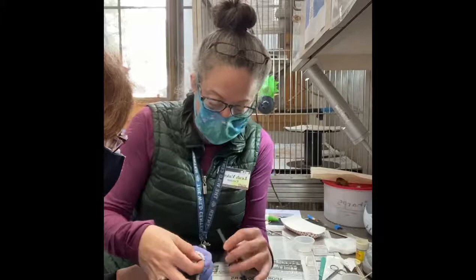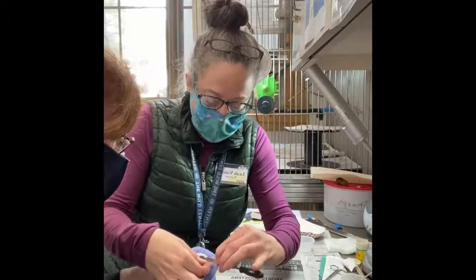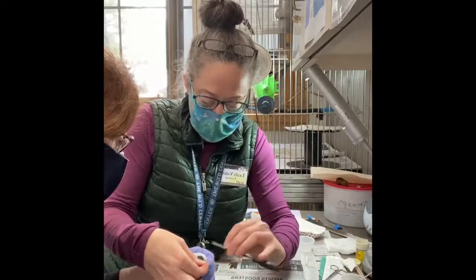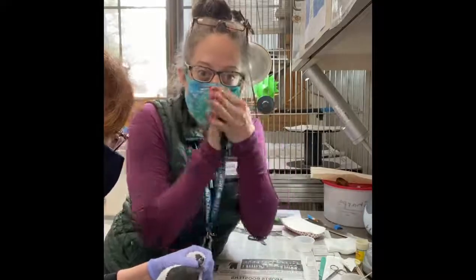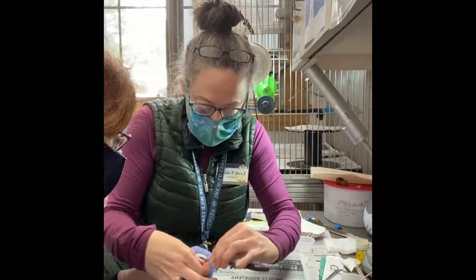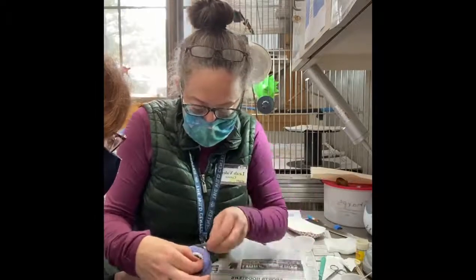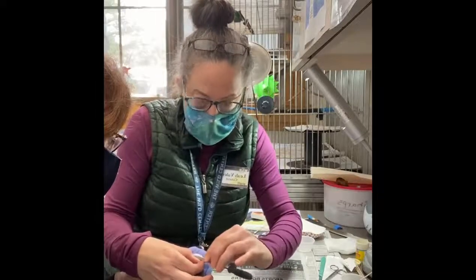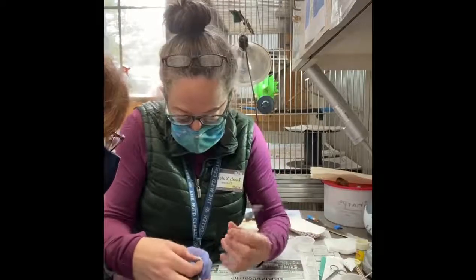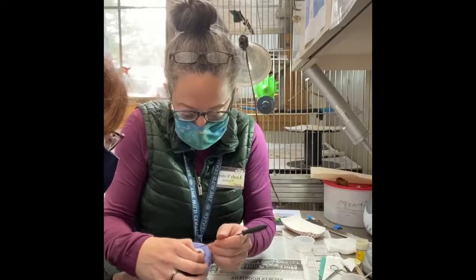It's like when you damage your fingernail — like in a car door, from experience, Ruth! So I'm going to try to file the edge of this so that instead of growing sideways I can get it a little straighter, so when I glue that feather shaft on it'll fit better. I'm being careful because there are blood vessels in beaks and I don't want to cause her to bleed right now — and glue can sting, so I don't want her in pain.